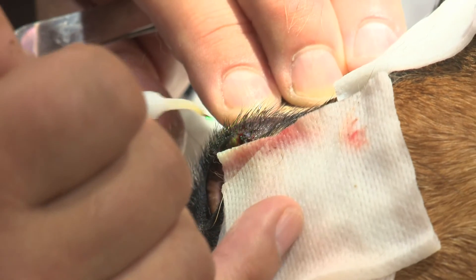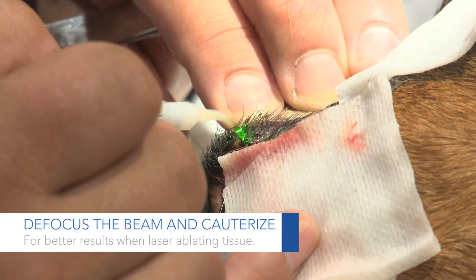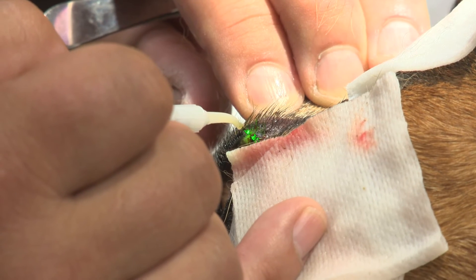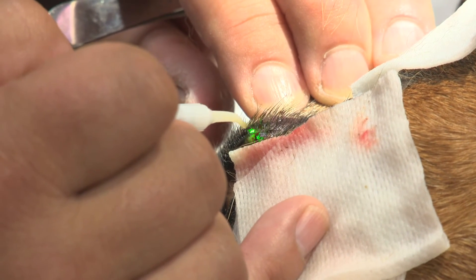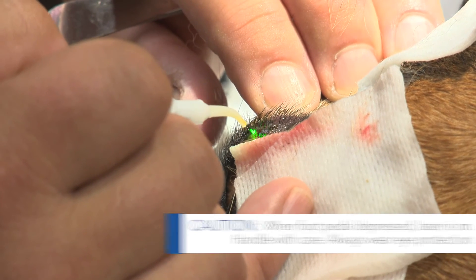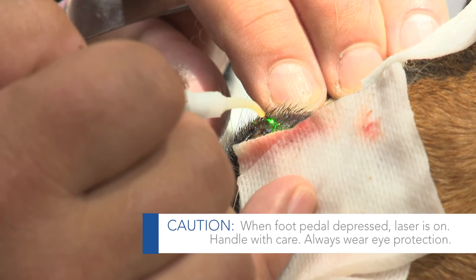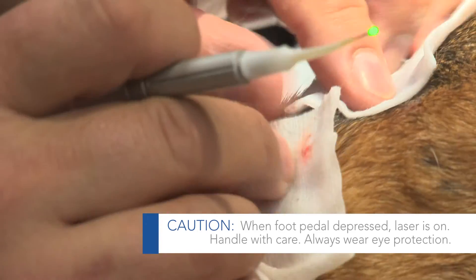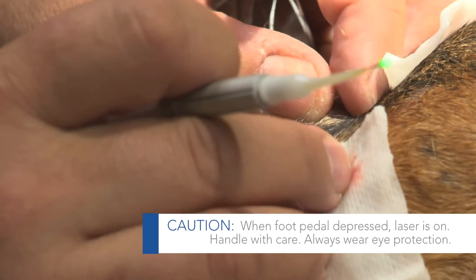I'm defocusing — so I'm actually off the tissue — and by defocusing it actually spreads the beam. It's a collimated beam, but you still get a bit of diffusion. And with that diffusion it actually decreases the amount of delivery of the infrared, the joules, and then you actually get some cauterization that occurs.